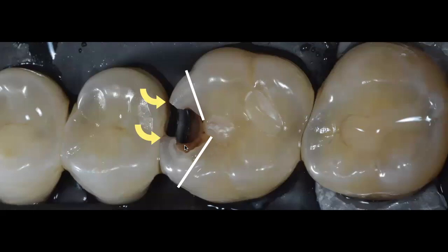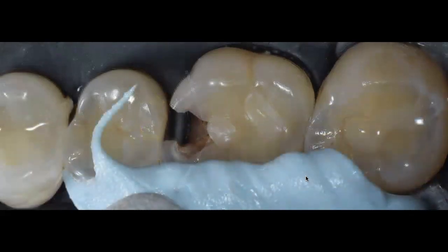But before I decide to remove it, and because this is a natural contour of that buccal and lingual embrasure given by that beautiful enamel that is still remaining there, even though I'm going to have to remove it, what I'm going to recommend for you to do is go ahead and make an impression using a bite registration material of that buccal and lingual enamel in that mesial box, before you remove the tooth structure. And that's exactly what I did.